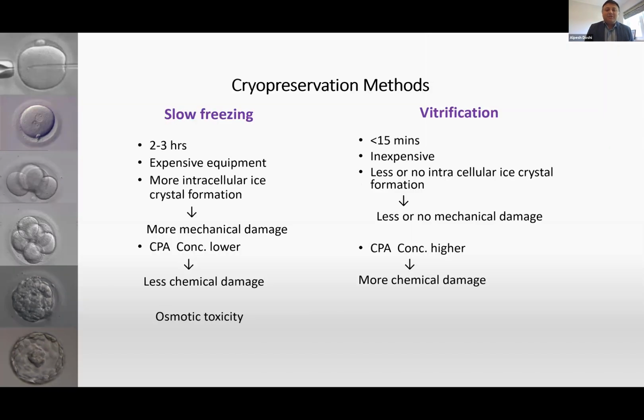This is something very close to my heart because I was one of the first embryologists to bring vitrification to the UK back in 2005. And we had one of the first babies born from vitrification in the clinic I used to work at. So I went and learned vitrification from Japan, from Tokyo, Hiroshima, and various clinics that were at that time performing vitrification in Japan. So I had the privilege to learn vitrification and warming from the experts and the innovators of the technology.